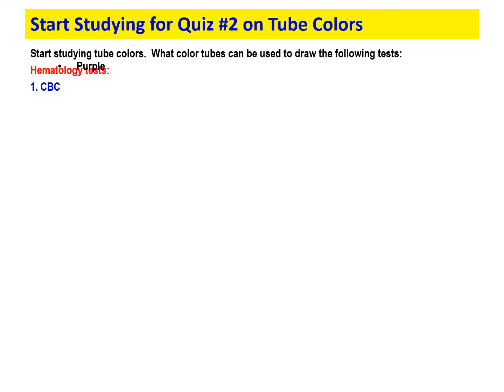So the thing I want to do is start off talking about quiz number 2 that you guys are going to have, and it's going to be on tube colors. So this little slide here will really help you guys be able to study and use this as a study tool to get ready for that test.